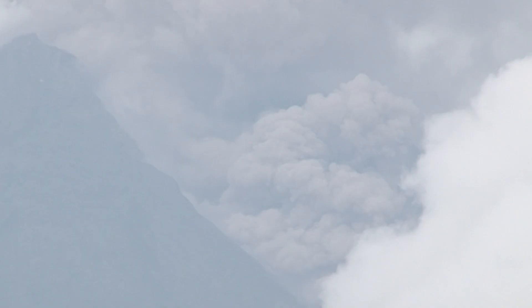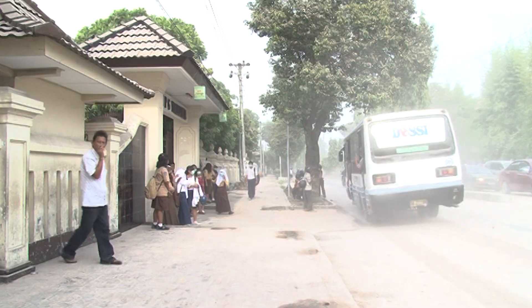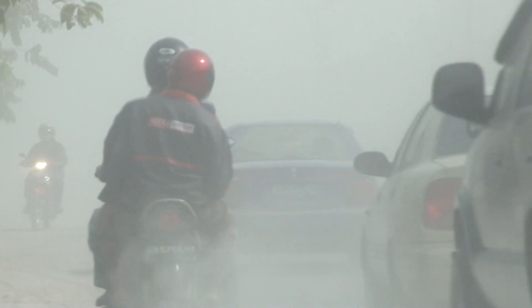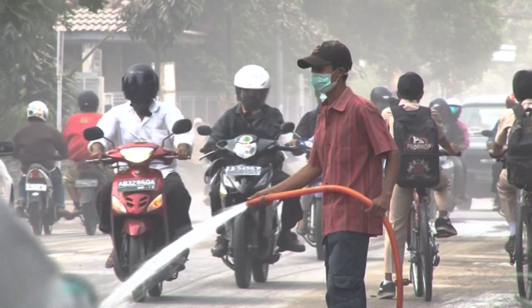Breathing volcanic ash and other particles can be uncomfortable and may cause serious health problems for some people. You may want to reduce your exposure to volcanic ash, or you may have been advised to do so. The best way to do that is to stay indoors, but if you are outdoors or cleaning the ash, you may want to wear a face mask. This video shows how to put one on so it will fit you well.